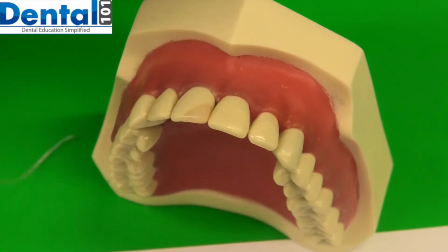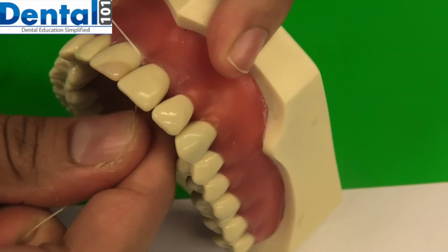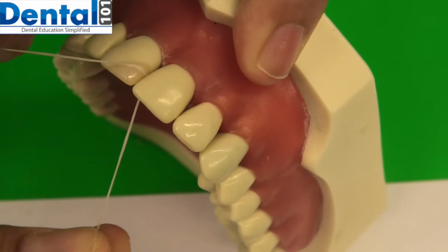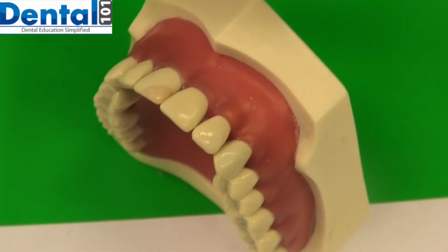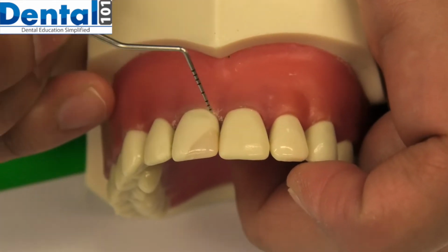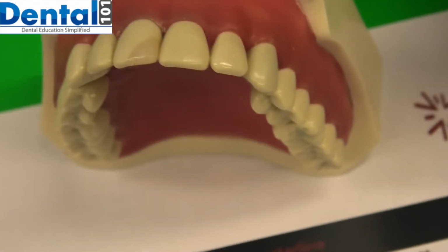In my restoration, let me show you how I check my cervical overhang. I put my floss, and now I move it along the tooth structure, and my floss is moving very smoothly over the tooth structure toward the restoration. So it means that there is no cervical overhang present on my restoration here at the junction of the tooth and restoration. I can't feel any cervical overhang with the floss. It means there is no cervical overhang present, so it is very good.